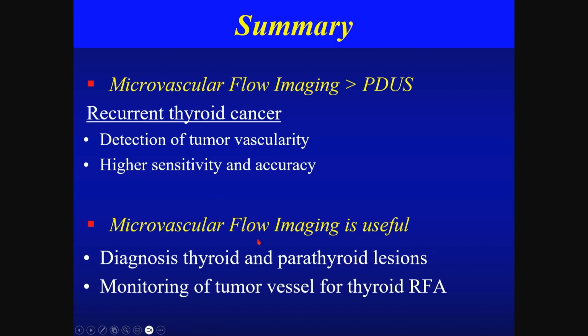Microvascular flow imaging is also useful for the diagnosis of thyroid and parathyroid lesions, and it is mandatory for monitoring of tumor vessels during thyroid RF ablation.